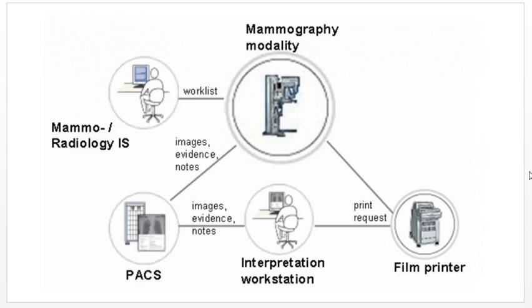Mammo is one of the places where most facilities still maintain some sort of printing capabilities. A lot of other places often get or want films of mammograms.